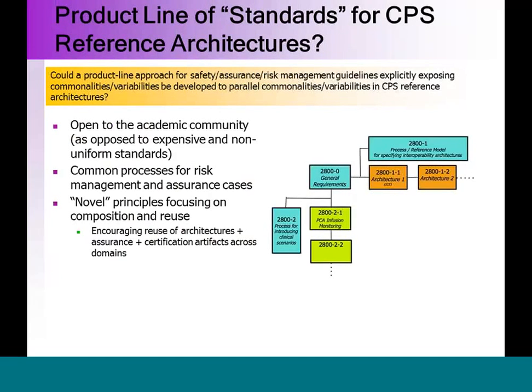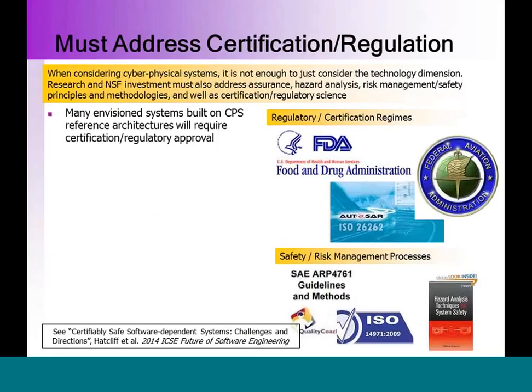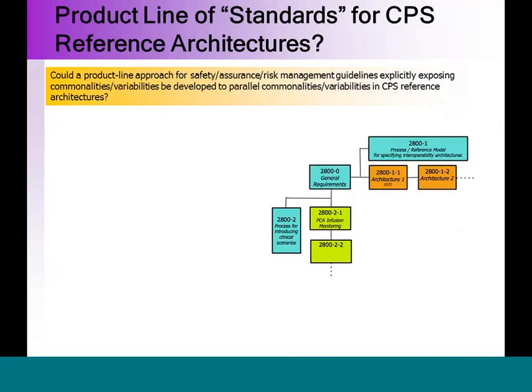Yeah, so let me make sure that you understand the diagram here of what we're doing. Maybe it's best just to work off this small diagram. The intention is that different architectures can be introduced. That was one specific reason why we said we're going to take the ICE architecture, which is the only one recognized by the FDA now, and it's going to be the first one that we address.